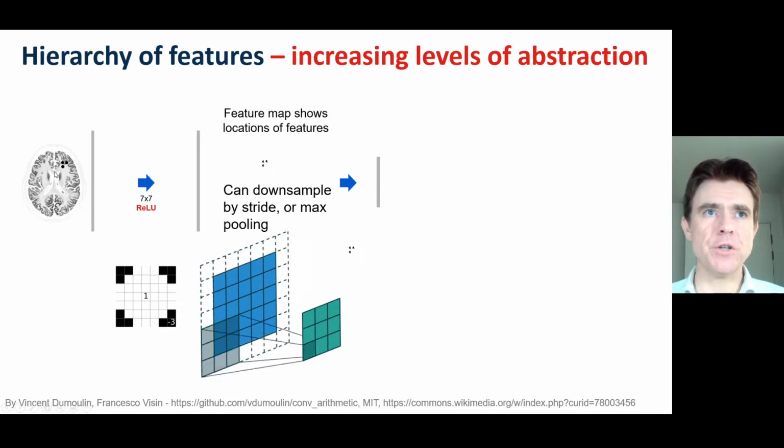So just like on the left-hand side here, we had 3 lesions and we had a feature detector showing where those 3 features are. Now we can use those 3 features together in a single kernel to try and identify groups of that feature.